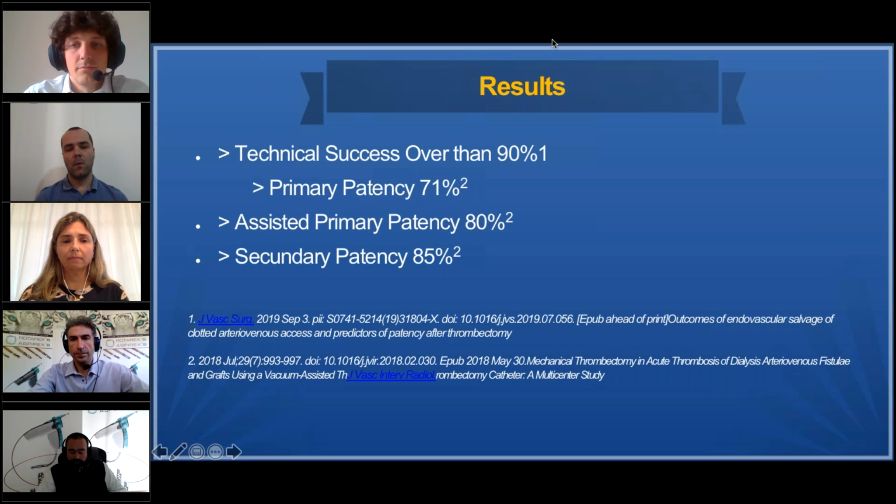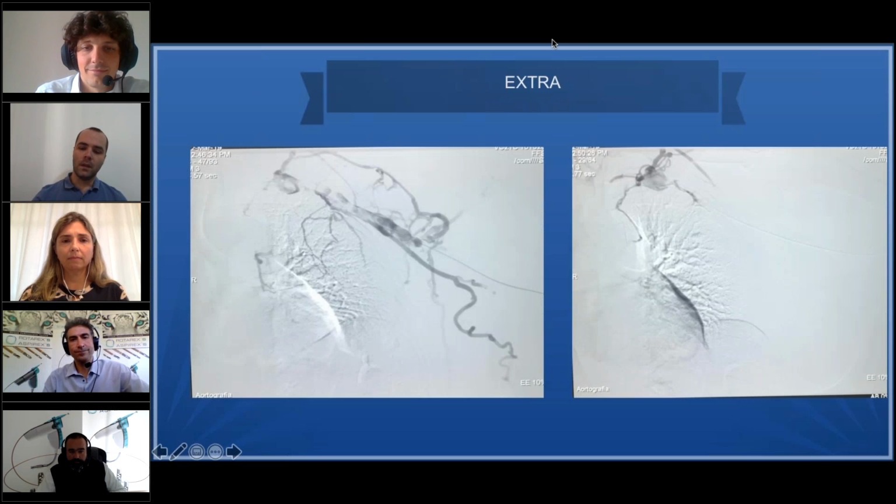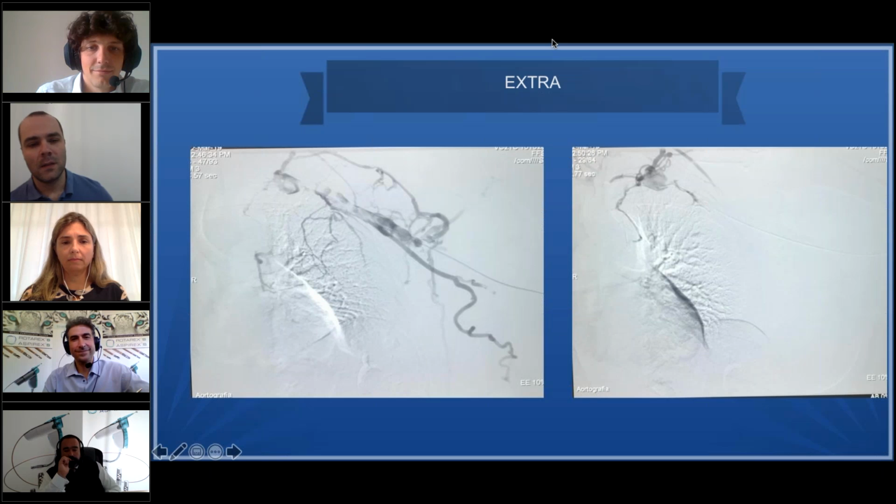So it's more for grafts than for native fistulas. Sometimes natives show up as a very challenging procedure. As Sergio said, I had some more time, so I will extend a little bit more with another case. That was a very challenging case with a patient that I treated one year ago.